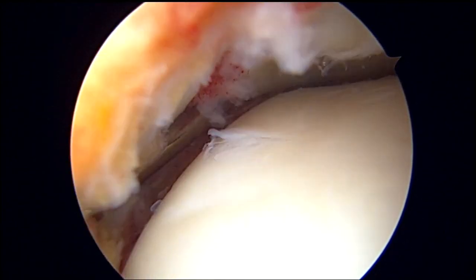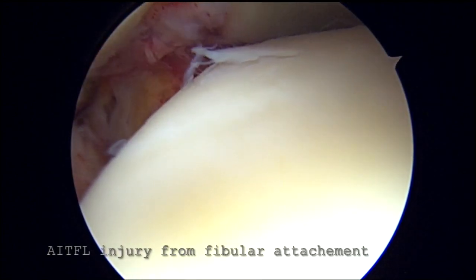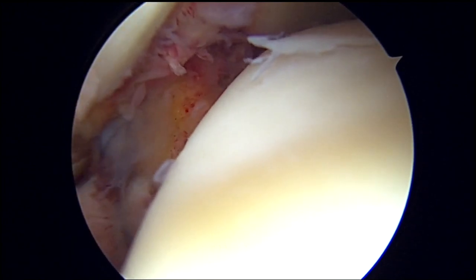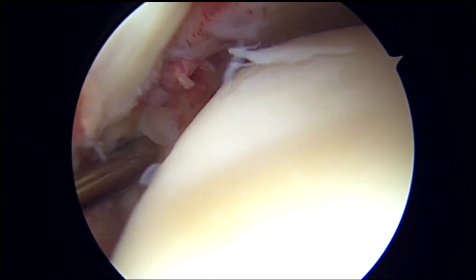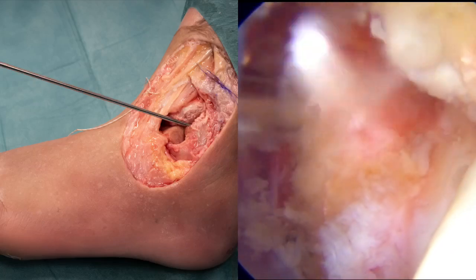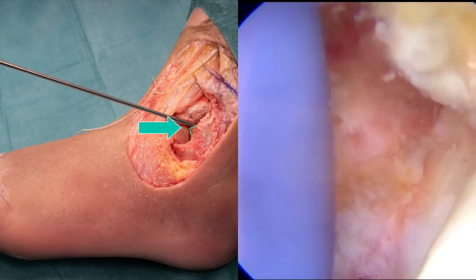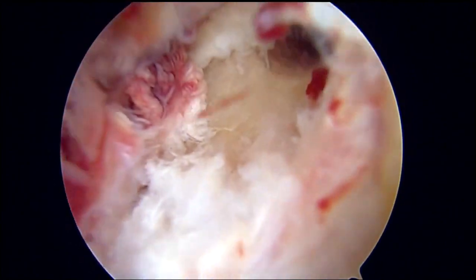With the arthroscopic hook, the AITFL is lifted from its fibular insertion side and we can see the injury. With the shaver, preparation of the bony fibular tunnel is done. The tunnel is placed just above the anterofibular tubercle, also called the Wagstaff tubercle, which will be in the lower central part of the native AITFL insertion.